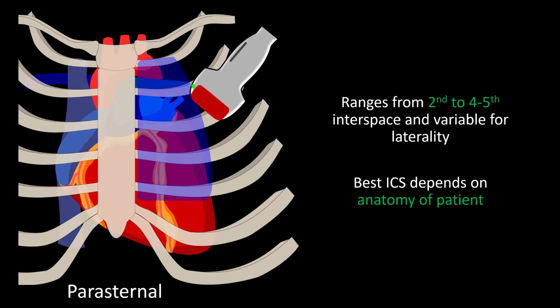In general, tall and skinny individuals tend to have hearts in a more vertical position. Thus, having a probe closer to the sternum is more helpful. Ventilated patients tend to have more difficult parasternals as the heart is squished midline and pushed down in the lower intercostal spaces.